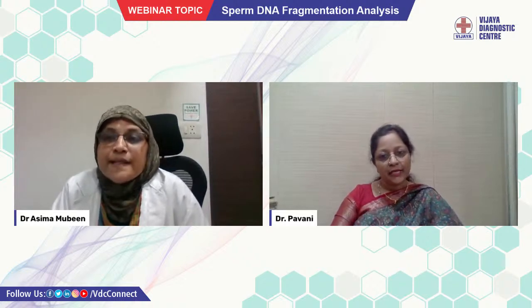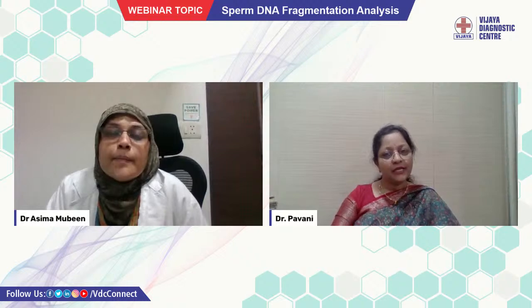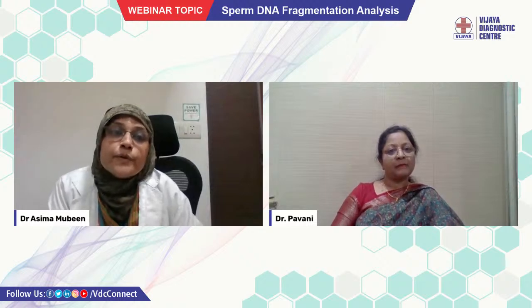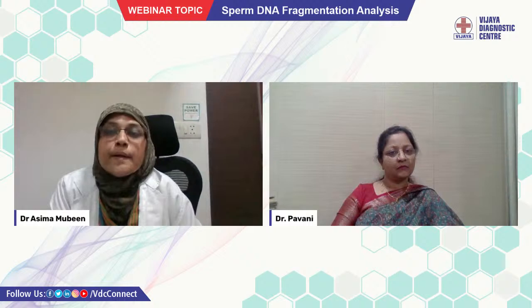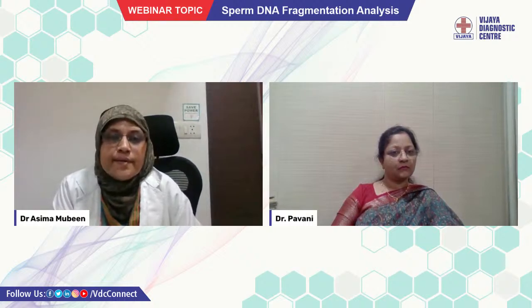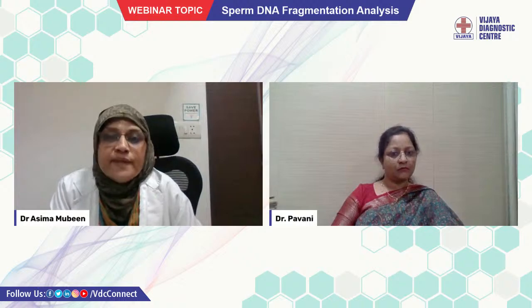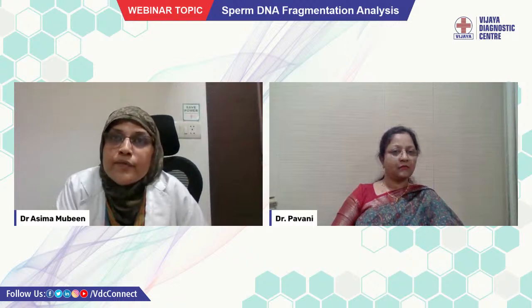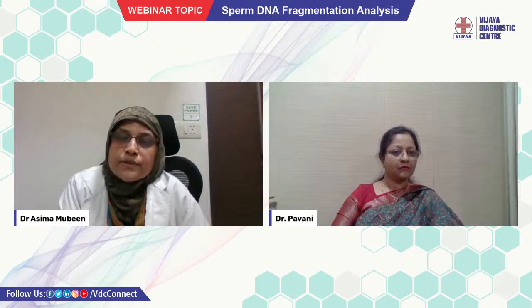Any interferences during the test analysis? Yes. It is very important, first of all, that before doing this analysis, we know the count of the sperm, because the dilution of the semen sample depends on that. It should be around 15 million, so there may be many dilutions. To prevent overlapping of the sperms, we have to be very careful about the dilution.